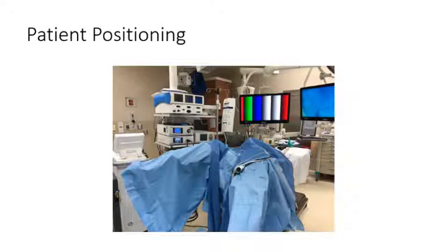Once the patient is placed in the dorsal lithotomy position, the operative steps include preliminary cystoscopy to assess if a calculus is in the bladder, urine is collected for culture, and preoperative antibiotics are given per the AUA guidelines. Under fluoroscopy guidance, a retrograde pyelogram is performed and a guide or glide wire of appropriate size is placed into the renal system. The goal is to adhere to the ALARA principle and use spot fluoroscopy images to obtain the critical images. After placing the initial guide wire, a dual lumen catheter is introduced under vision and a working wire is introduced in the collecting system.